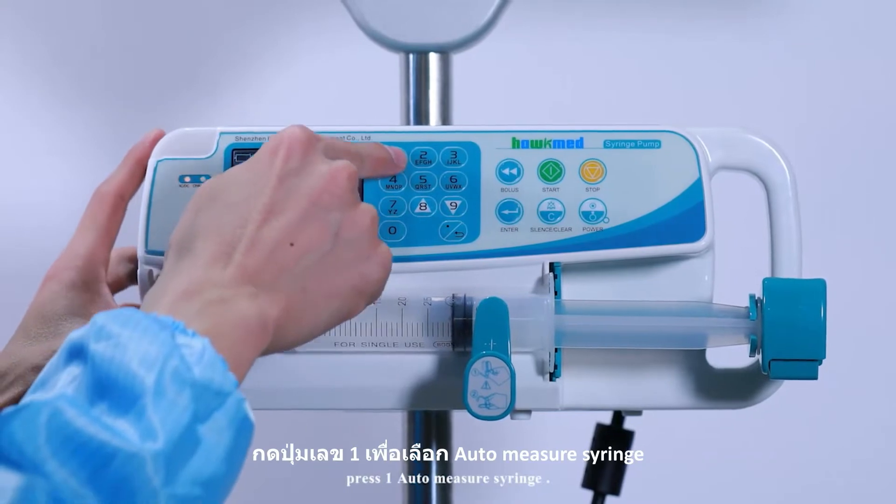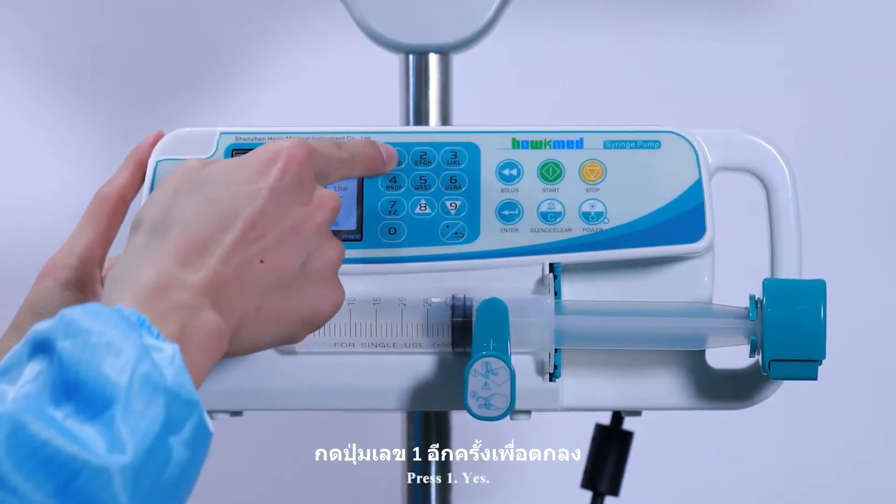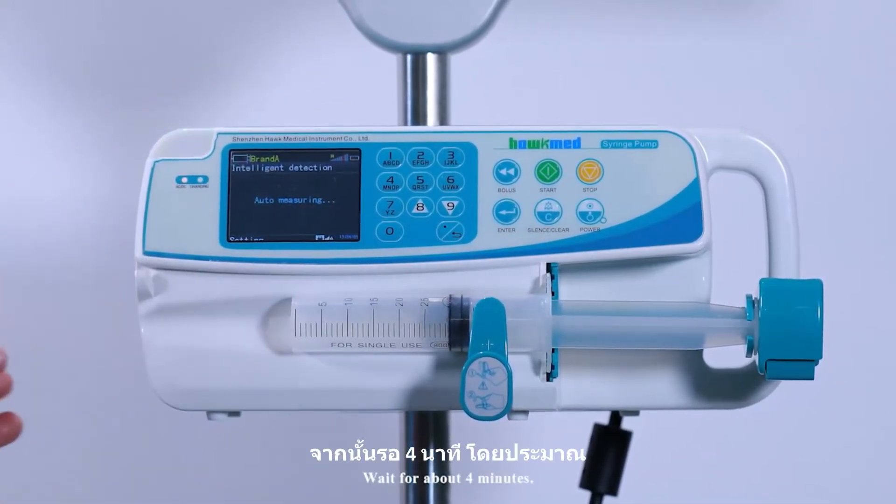Next, press 1 to auto-measure the syringe. Press 1 again to confirm yes. Wait for approximately 4 minutes.